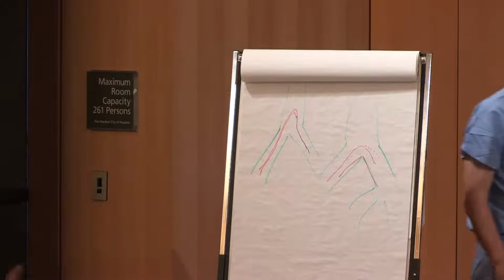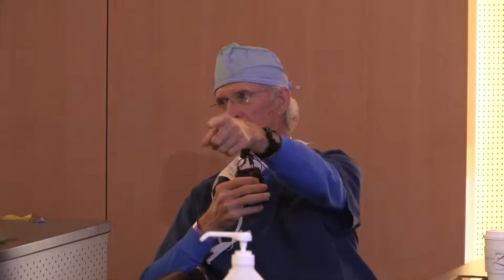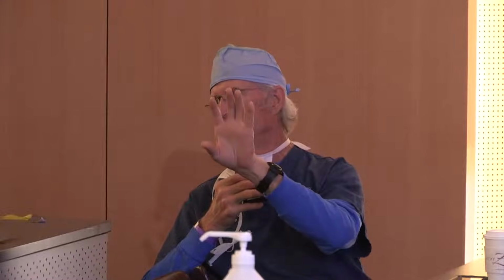It's the concept of one-to-one movement. If you're pushing a wire on the back end, you've pushed it in 2 inches and the tip didn't move 2 inches, well, that 2 inches got taken up somewhere. And it's particularly true when you're working on a popliteal or a tibial and your bifurcation is not in the picture. And you're down here pushing away and nothing's moving, well, that's because your sheath is getting pushed up into the aorta. You're accommodating that length somewhere else in the system.